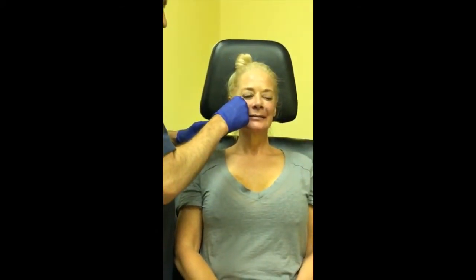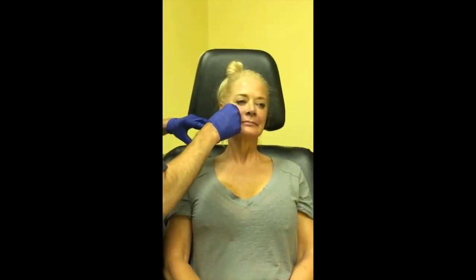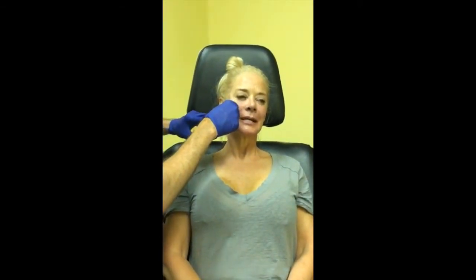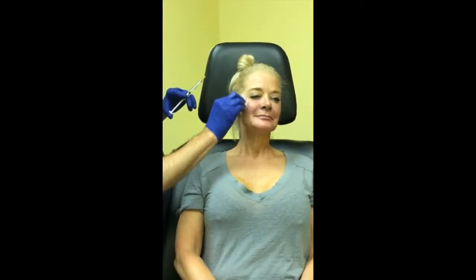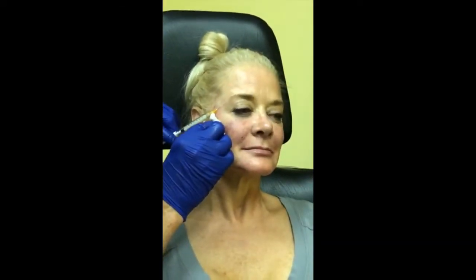Because if you overshoot here you'll look like a scary Real Housewife who's had way too much. This area is completely numb from the block. It's really genius that they put lidocaine right in the Belafill — they should do that with Botox too.